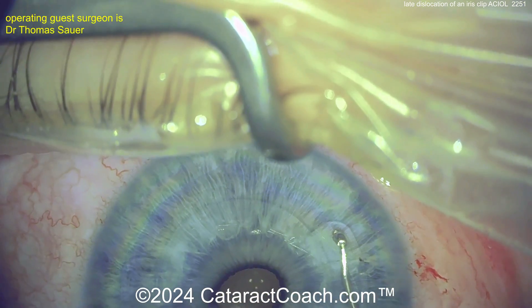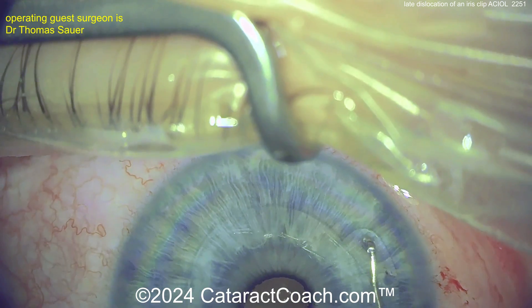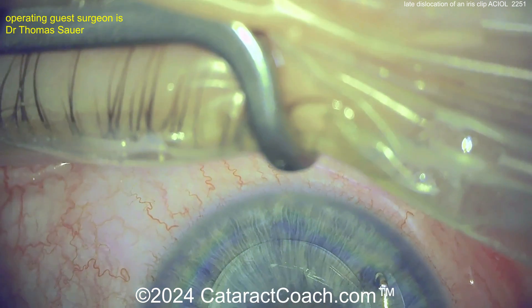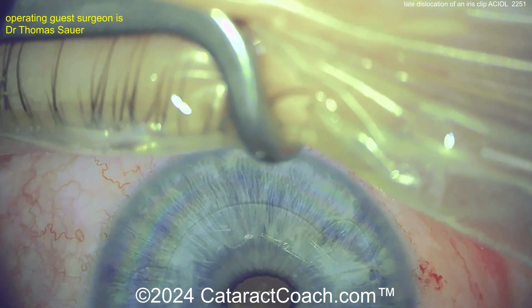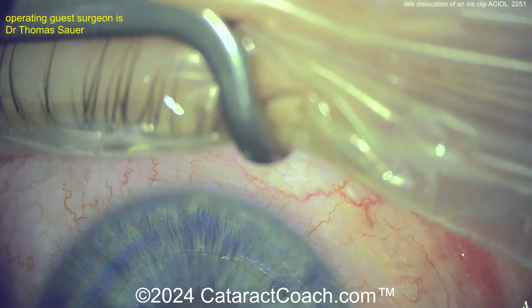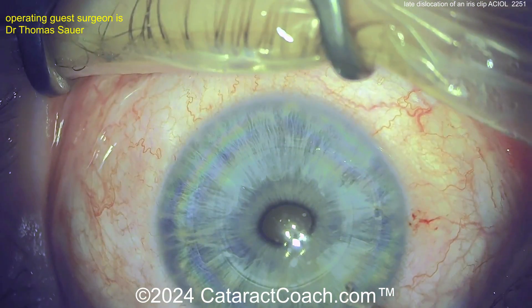We don't have these aphakic iris clip IOLs available in the USA. But zooming in, you can see we were able to get a good solid bit of iris stroma trapped in that clip, and now that should be pretty darn stable.